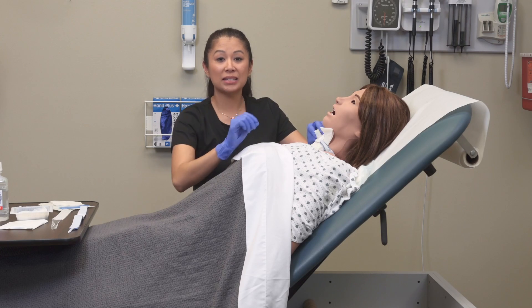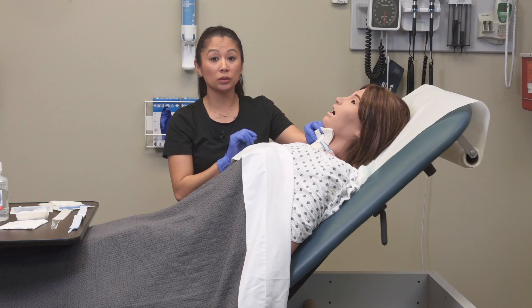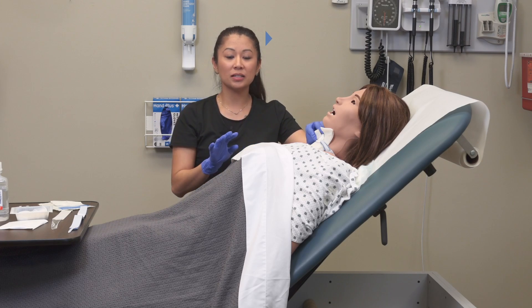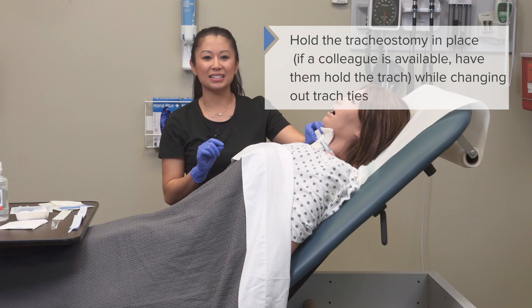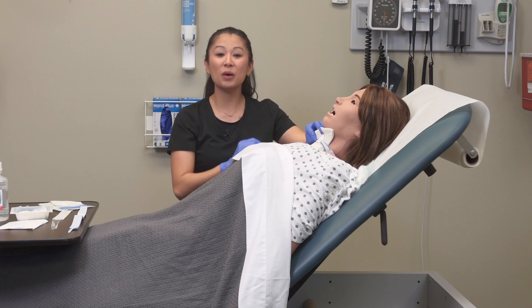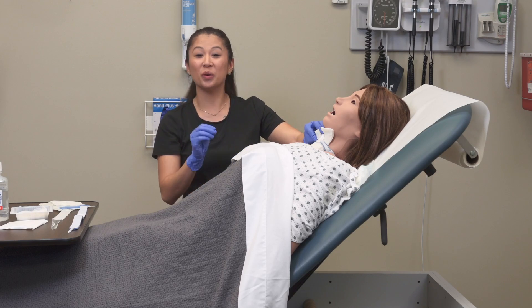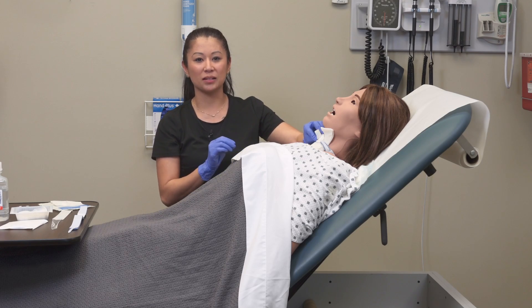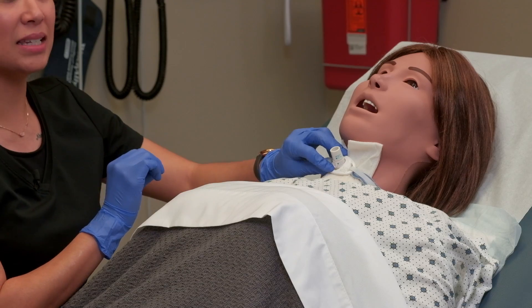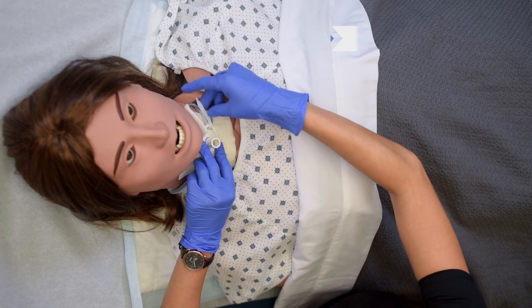Now that I've applied my sterile tracheostomy dressing, I want to make sure I hold on to this. If you had another set of hands, have a colleague hold the tracheostomy in place as you remove the trach holder. I'll show you what I do when I'm alone — I'm holding this steady and going ahead and loosening up this trach tie.